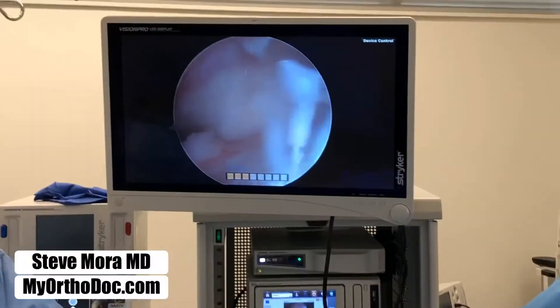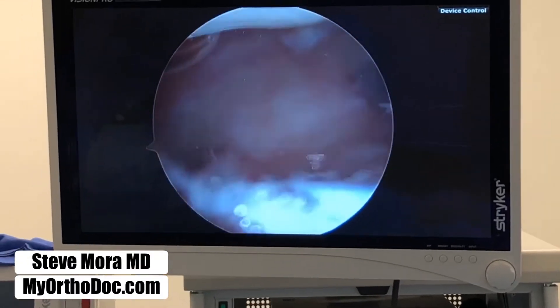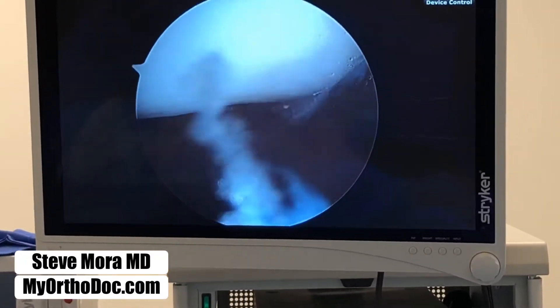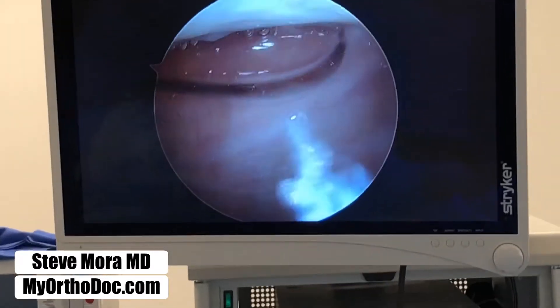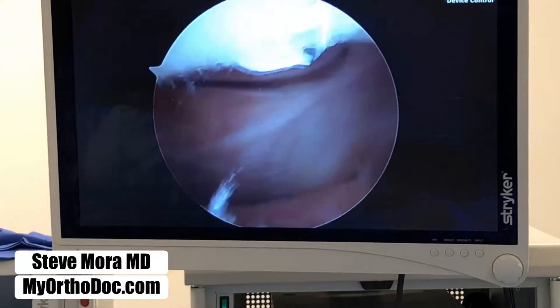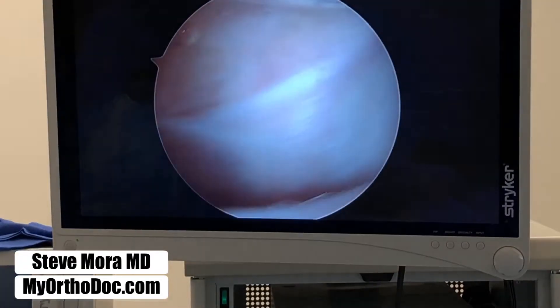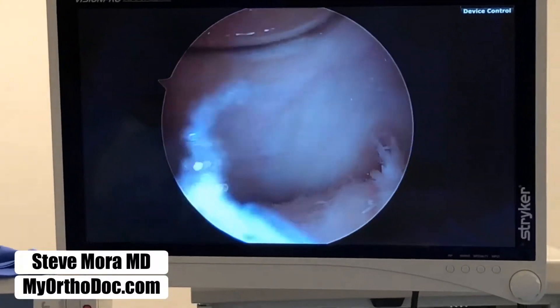There's the screen — we're in the joint. The joint is being filled with water. One of our tubes here is attached to a pump. It fills the joint with water, expands it, separates the surfaces from each other so that now I have room and can actually explore the joint.